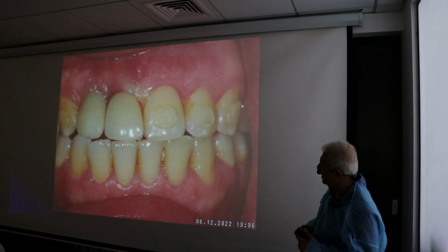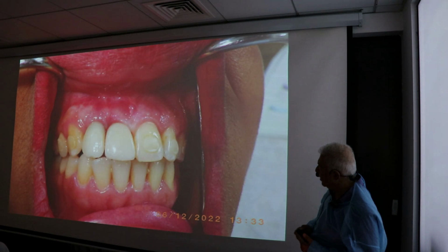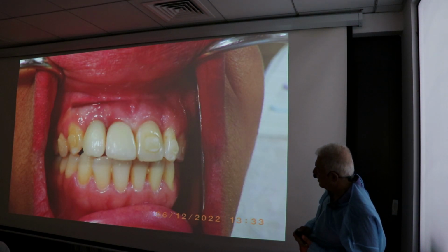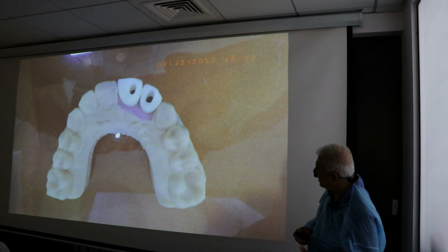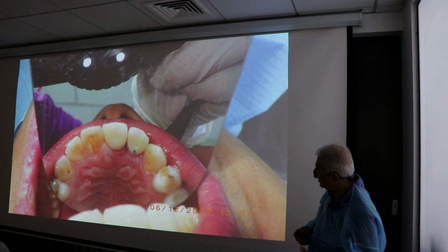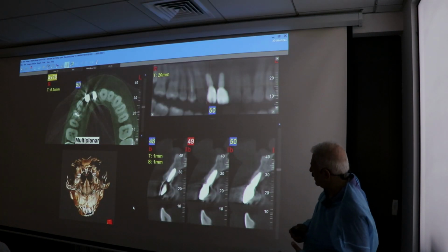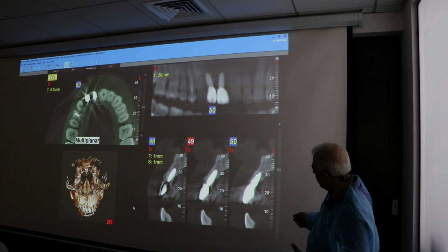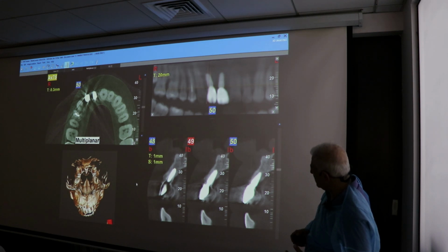So as Dr. Nabil is asking, what about the soft tissue? From here, slowly it's maturing with the ceramic. These are zirconia screw-retained crowns, which means the angulation was fine. This is the bone at the time of crown placement, which is not bad, but interdentally, it's not nice.